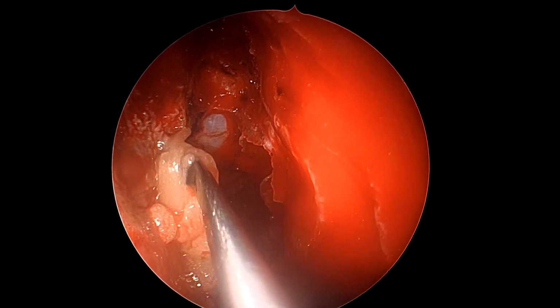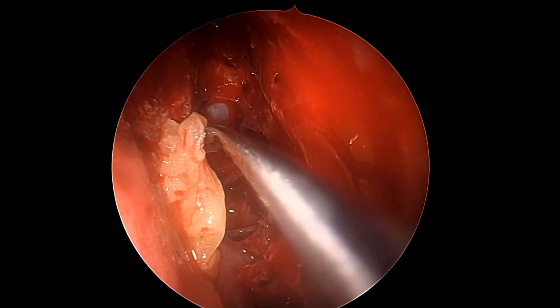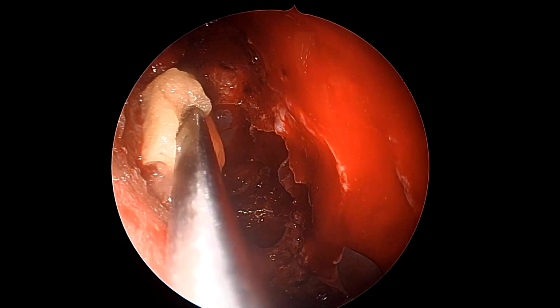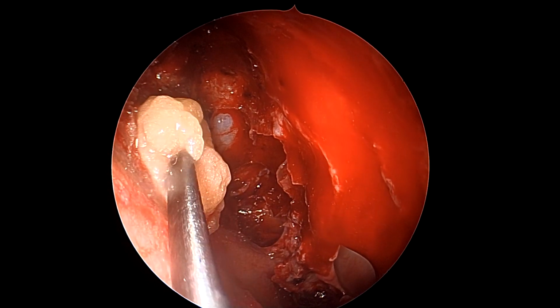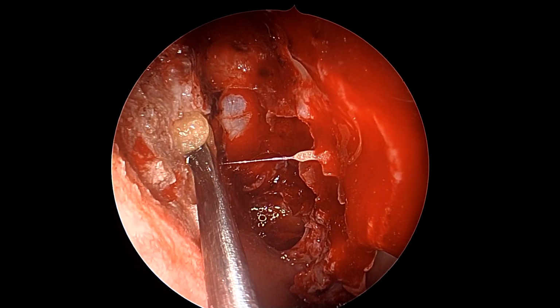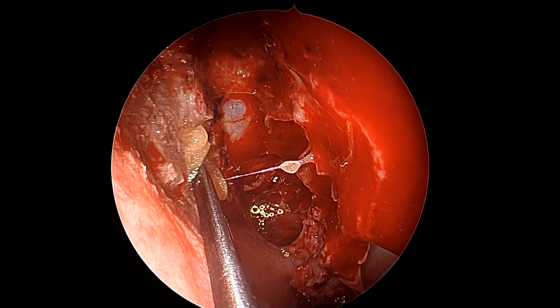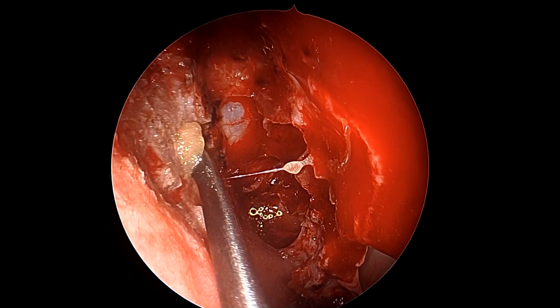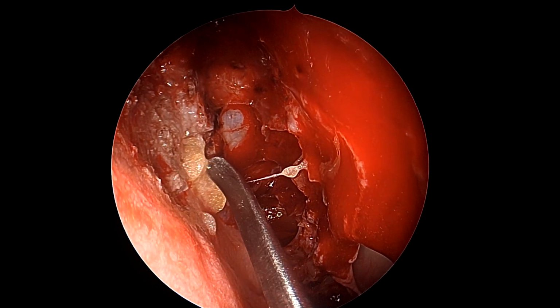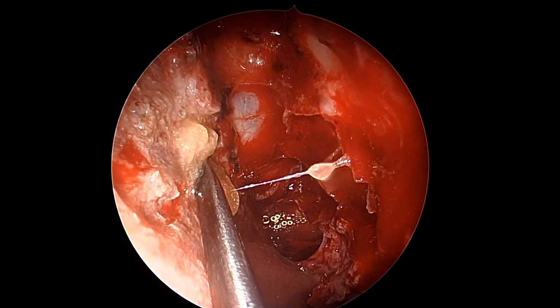Now we use fat, and the fat has to be gradually and very slowly tucked in and pushed inside the defect. The fat must be sized appropriately. A very big fat size like you saw earlier would not go in, and then it has to be trimmed to a size that can be pushed in. One cannot use force here, and we don't ever advocate using a ball probe because it kind of pulls the fat back. So normally we use a blunt tipped elevator, a long elevator, to gently, slowly and steadily put the fat in the site of the defect before we resort to using the fascia.